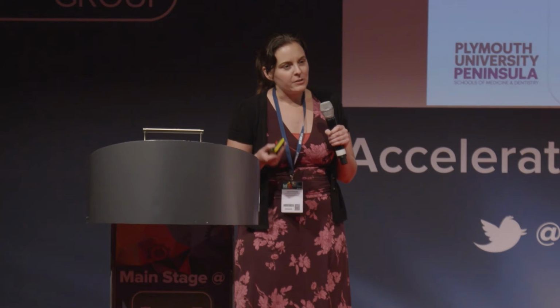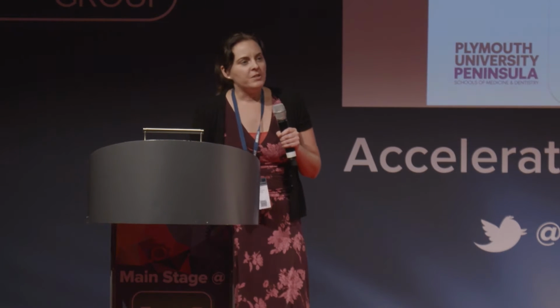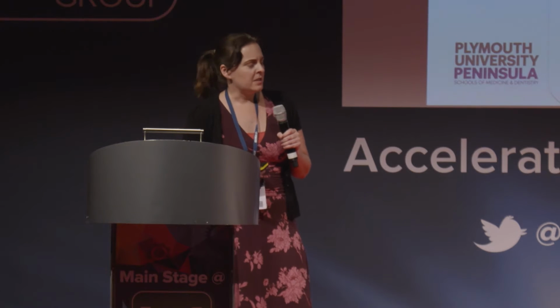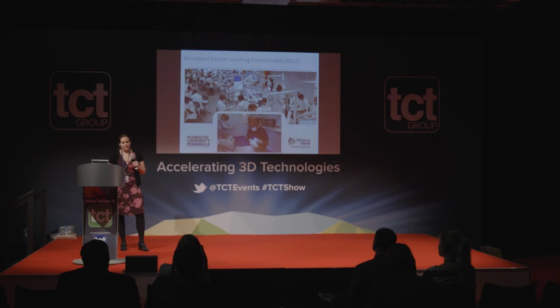And these phantom heads, they're basically like quite high-tech crash test dummies. It's like half a torso. You can lie them back on the dental chair. They've got a plastic head and some quite stretchy rubber cheeks. And basically what we do is we put different jaws and different teeth inside these phantom heads for our students to practice on. And they practice all their procedures first on these models before they go on to real patients.